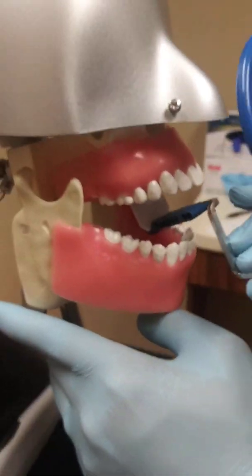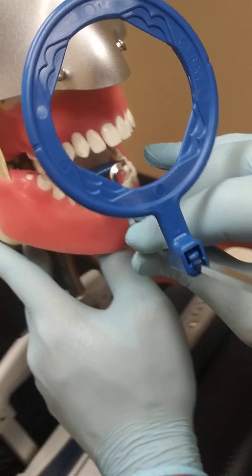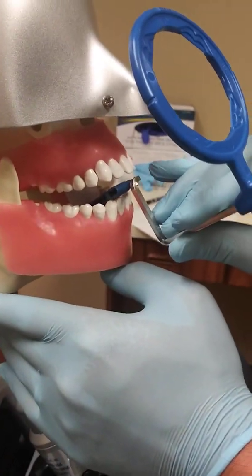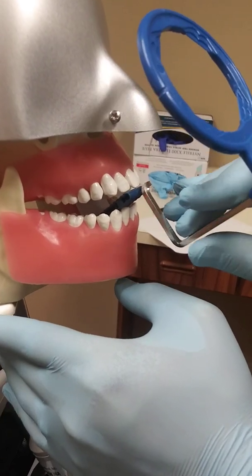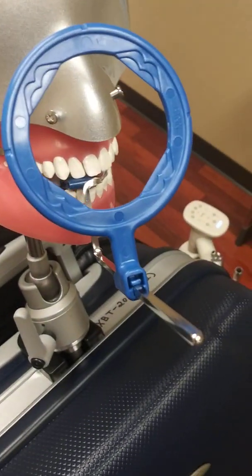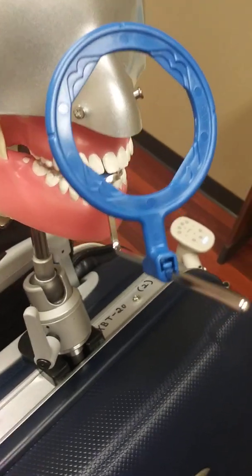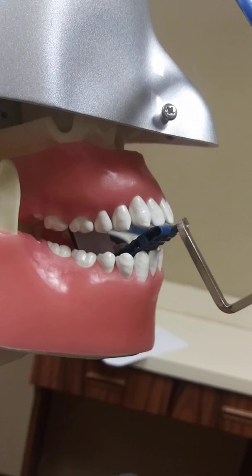So you want to position this more towards the center of the mouth. Make sure that we are getting directly on number seven — you want to center your film up to number seven. Then you ask the patient to lightly bite on the stick. Just like that. The patient has bitten down on the stick and the film is in position.